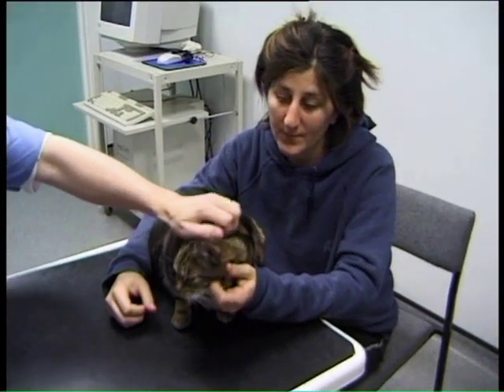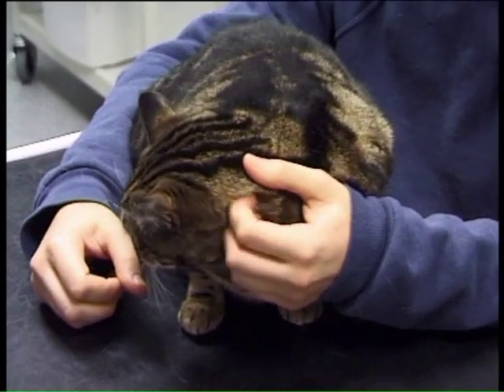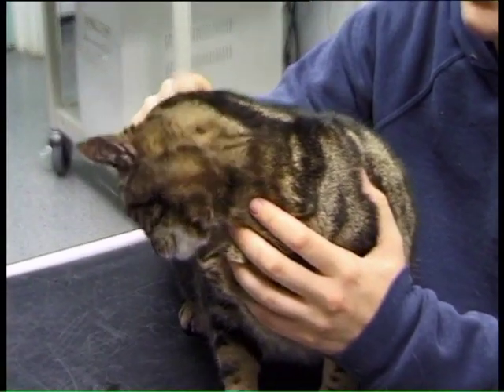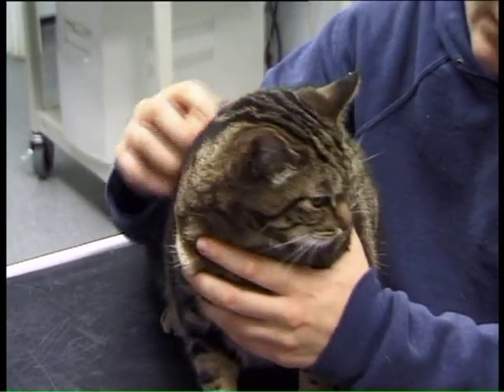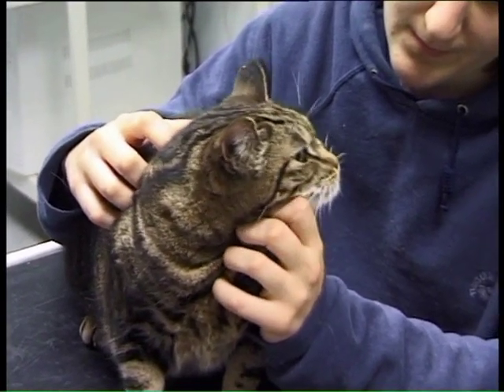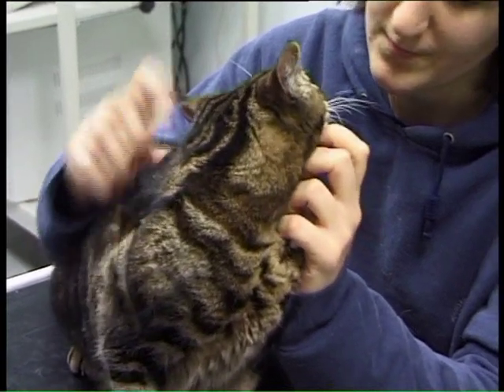When you're measuring blood pressure in the cat, it is important to try and do it in as stress-free a manner as possible. So we like to let the cat settle down in the environment for a few minutes before actually trying to measure the blood pressure, preferably doing it before any other procedures such as clinical examination or temperature taking. And it's better, if possible, to have the owner present as well.